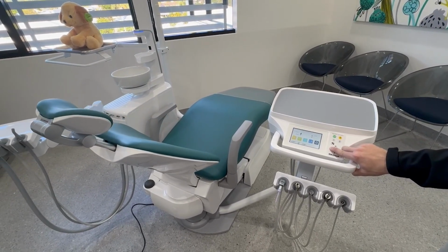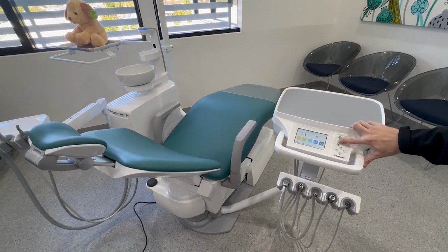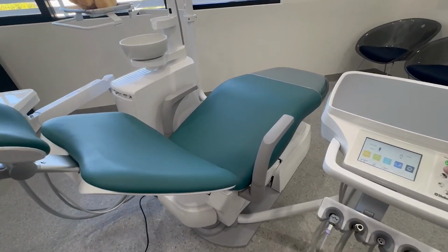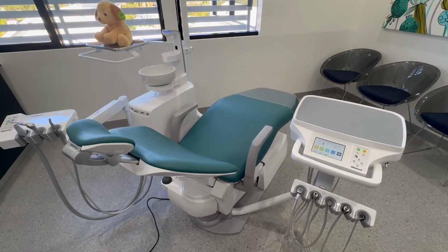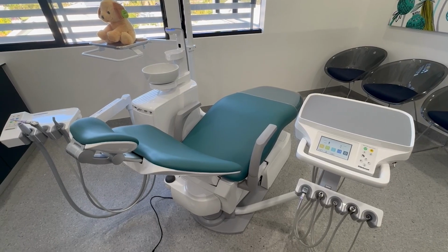And then once we have it in the position we want, we're just going to hold down the number 1 button in this case because we're presetting that. Now we hold and we wait. Now when we listen, hopefully you can hear that. We had a little musical tune there and a solid beep. That means that is now locked in as our new program number 1.